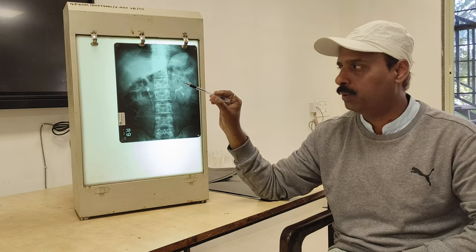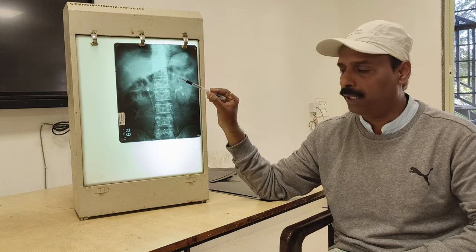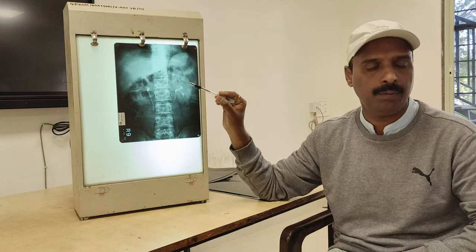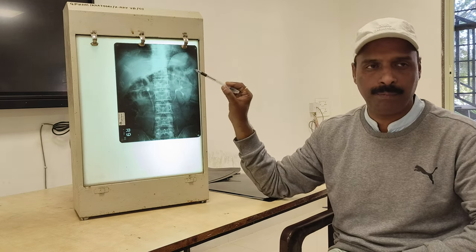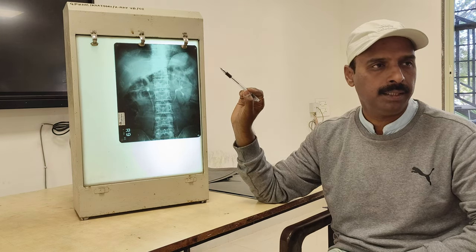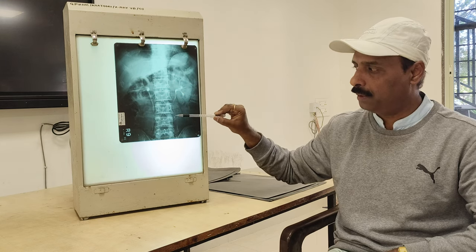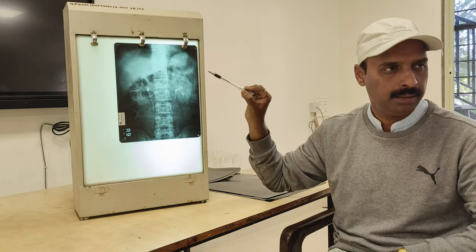First step, you advise a KUB, the plain x-ray. But afterwards, if you want to confirm the size and exact location of the stone, then we advise intravenous pyelography. So you should not confuse the plain KUB with intravenous pyelography. Here you can see the kidney shadows, the right kidney and left kidney. Here the ureter you can see.